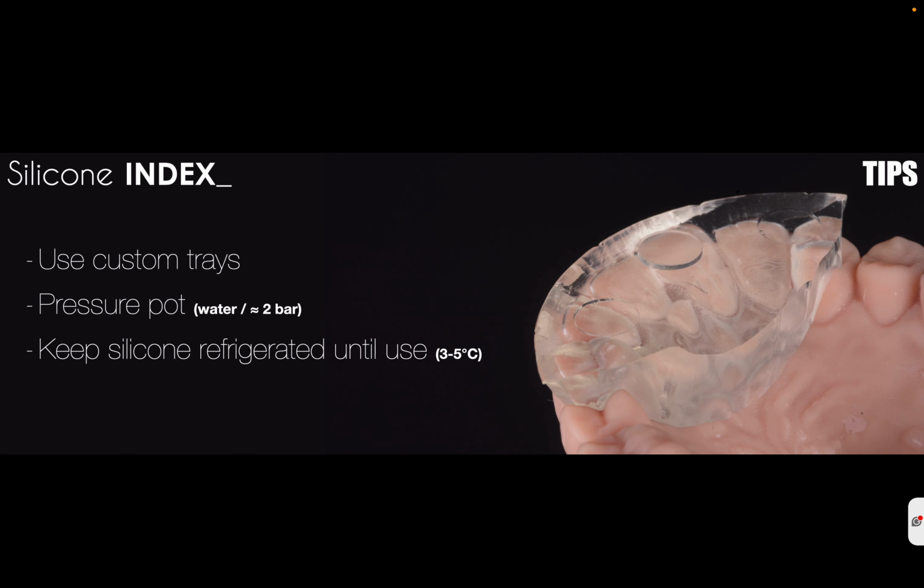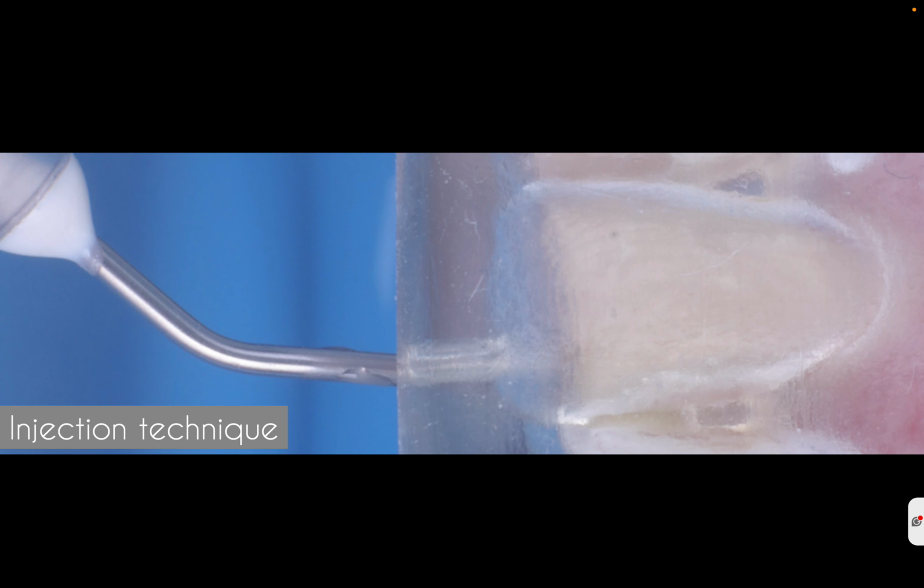And then, if possible, before doing the silicon key, try to keep the silicon cool in a cold place. Why? Because if you put the silicon in the fridge 1 hour or 30 minutes before, this silicon is going to work slower and you have more time when doing the silicon index.